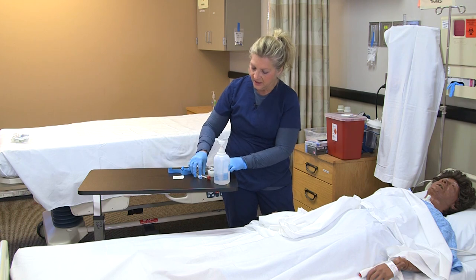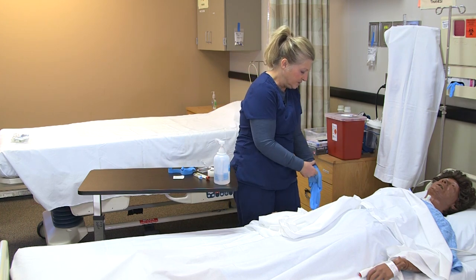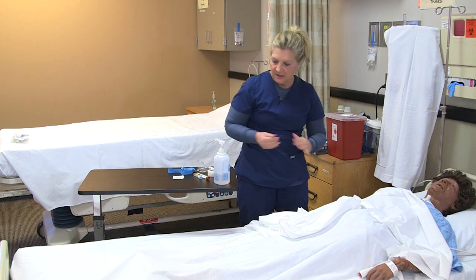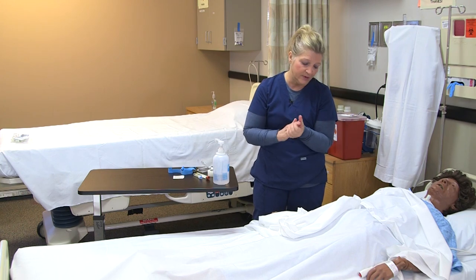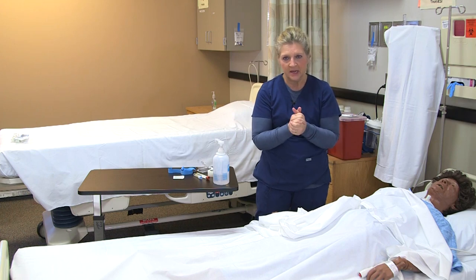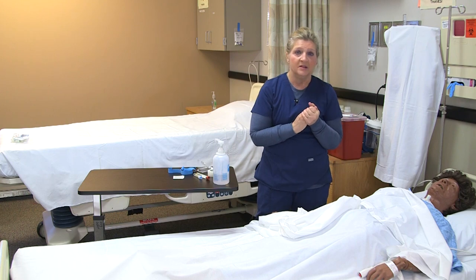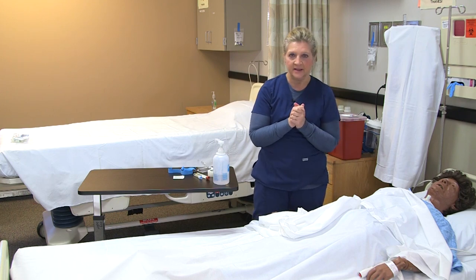Remove your gloves and wash your hands. Label the blood tubes in front of the patient and transport them to the lab as soon as possible, per your facility's policy and procedure. Also, don't forget to document what you did and how the patient reacted.